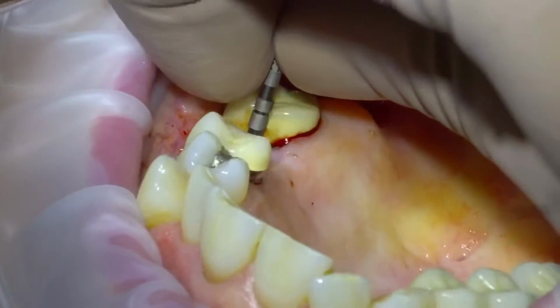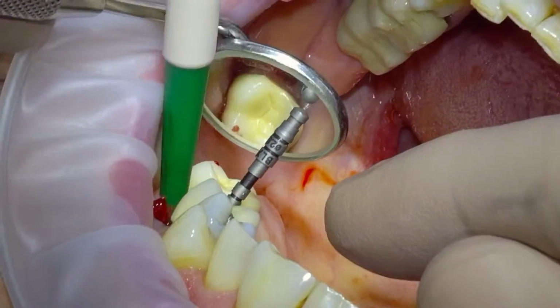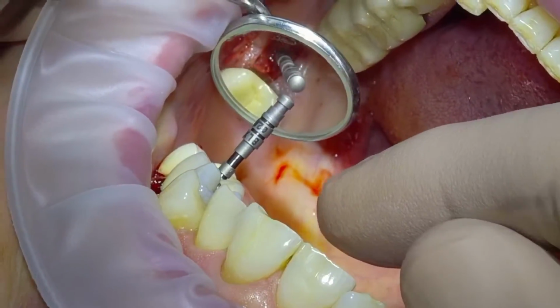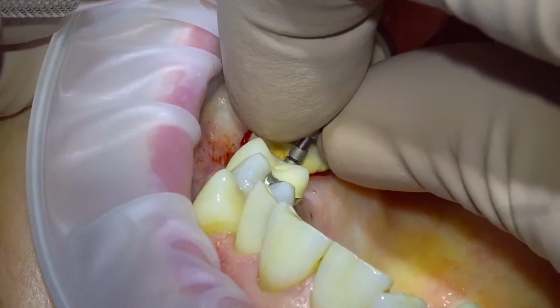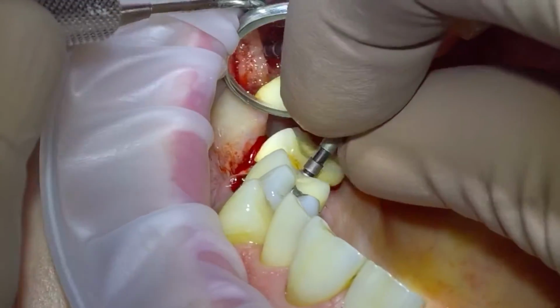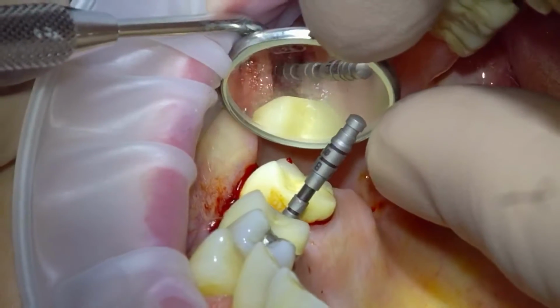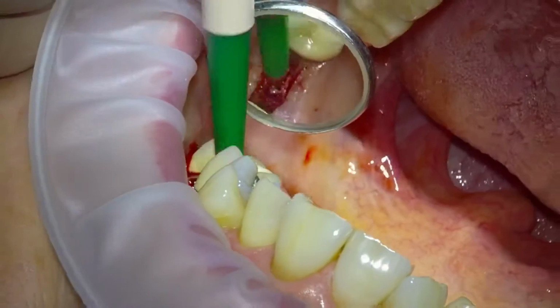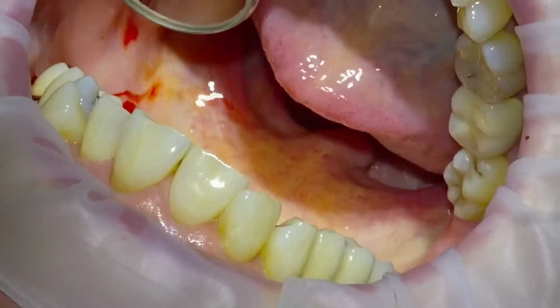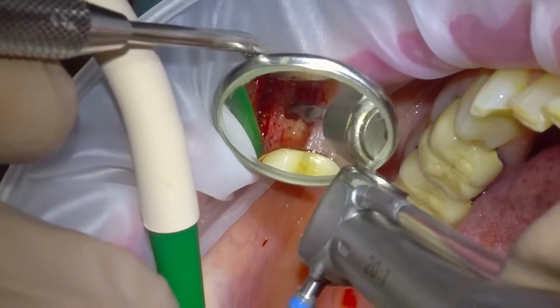And of course, as always with implants, with all the implant pieces, we're checking the angulation, but we're also watching the back of the throat because we don't want to drop anything down there, as you can see from the video. And so we're just checking for angulation for the screw retained crown. We're quite close to the sinus floor as well, so I'm just checking for a good apical stop and length. There you go, you can see the back of the mouth there. One way to minimise that is to just get the patient to close ever so slightly.